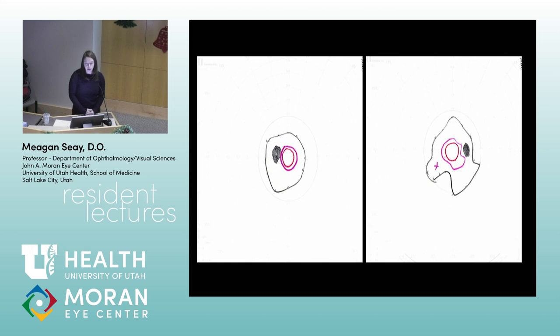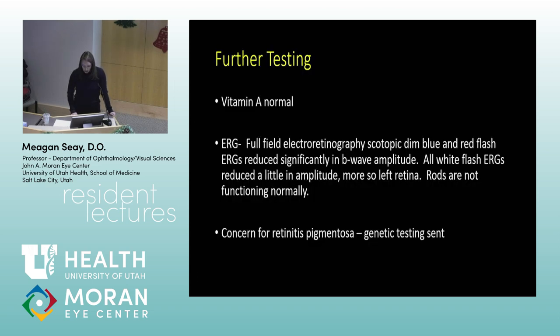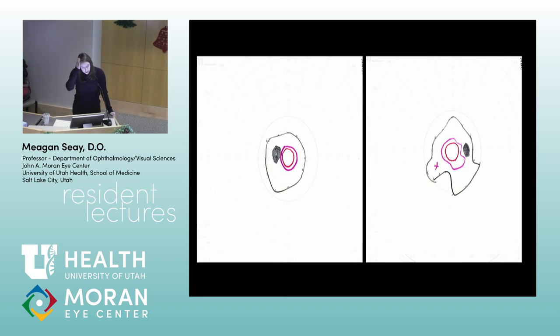Yep. If you don't have a tangent screen, you can do a similar thing just with confrontation. And same thing, you just back up and their visual field should expand. But if it's staying the same, or a lot of times getting smaller, then that's concerning for non-physiologic. So this one I sent her for more testing.